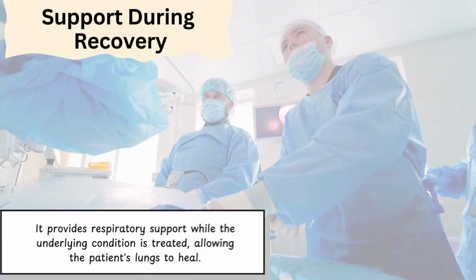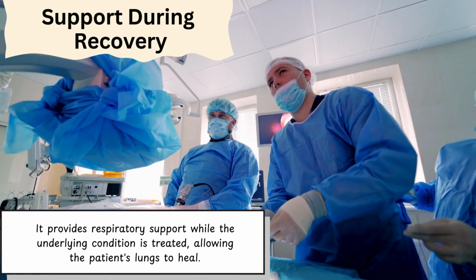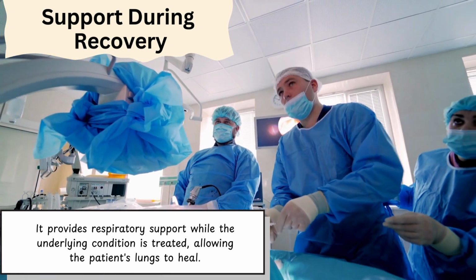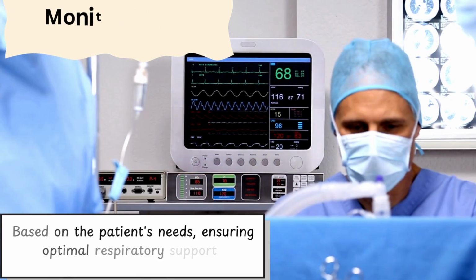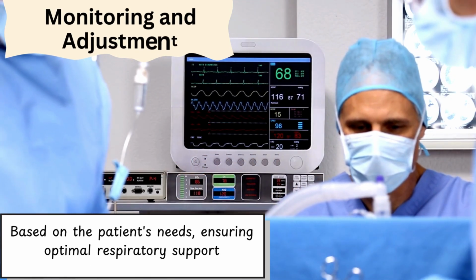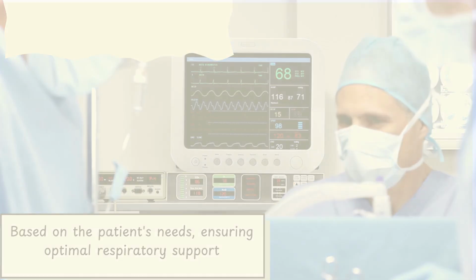Control of breathing: in some cases, mechanical ventilation can take over the entire breathing process, allowing healthcare providers to control the rate and volume of breaths delivered. Monitoring and adjustment based on the patient's needs, ensuring optimal respiratory support.